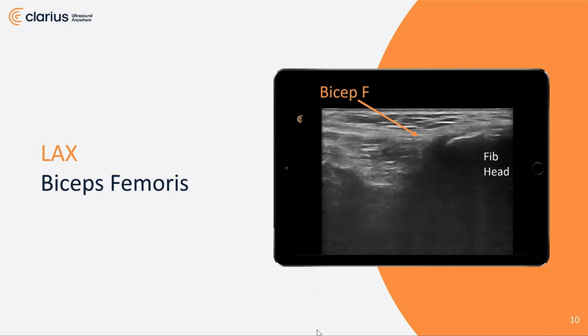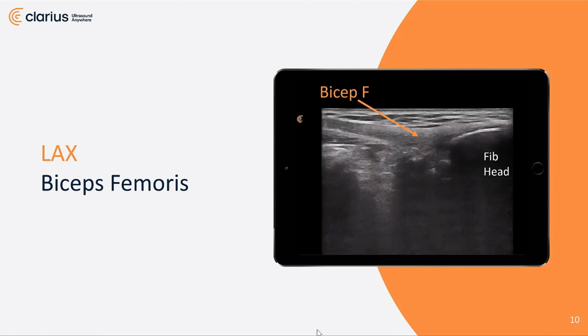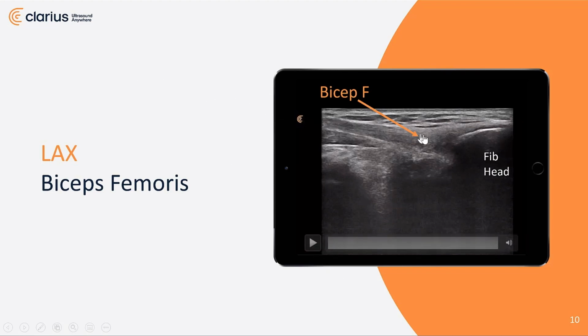You'll see that from the top left of the screen, the fibers, the long strand collagen fibers coming from the muscle structure that's up here a ways, come down and start to go apart and attach themselves to the fibular head. Now, though we see a little bit of darkening in this area here, which could represent some fiber strain, we don't see an overt swelling or darkness of fluid that exists there.